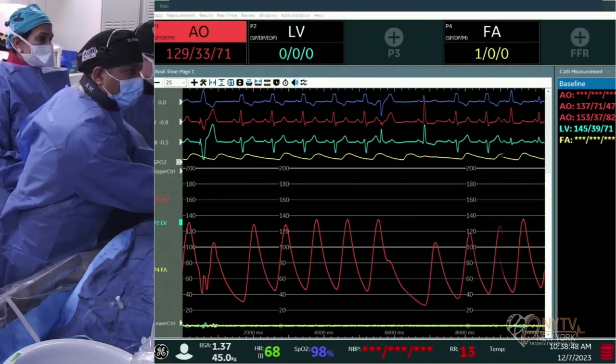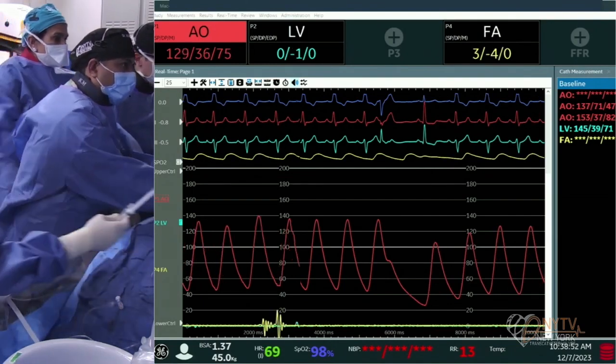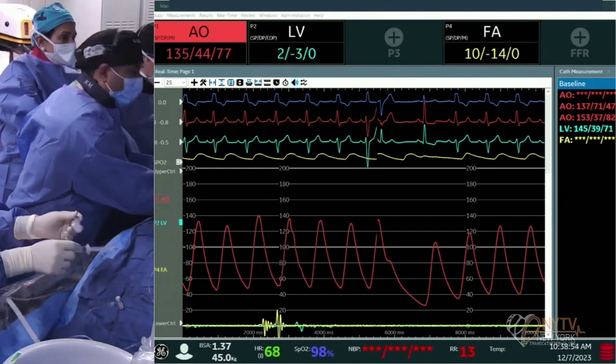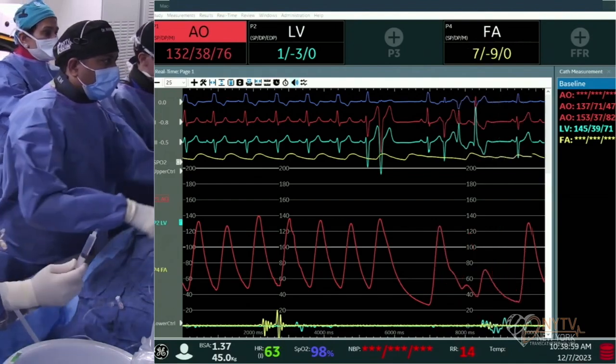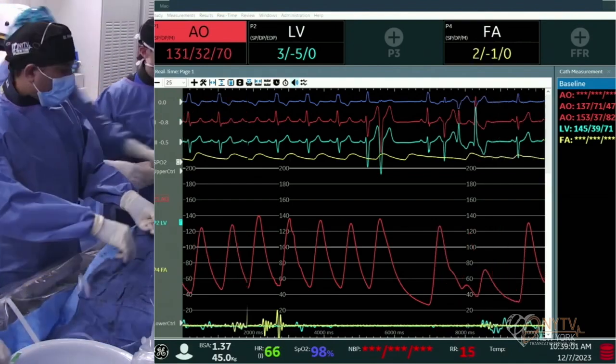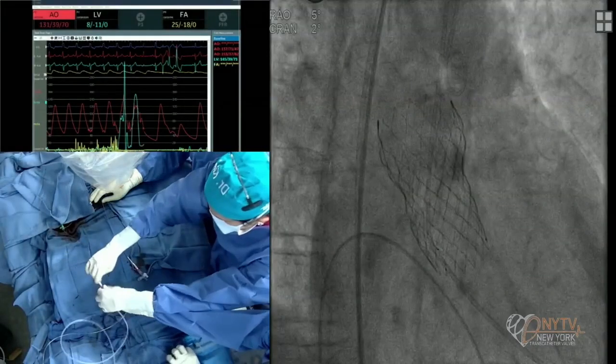Just be careful from that point of view also. Yep. Pigtail has to go down. The pigtail, it's caught in the inner. Yep, good. Okay, all right. So let's do some hemo and flush. In the meantime, I'll show the audience the coplanar view, which is 17.1.